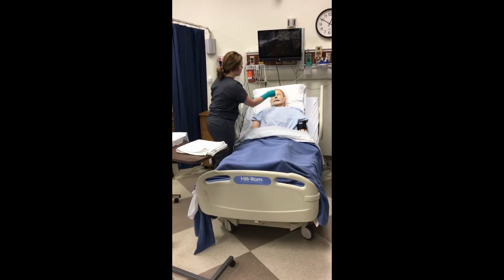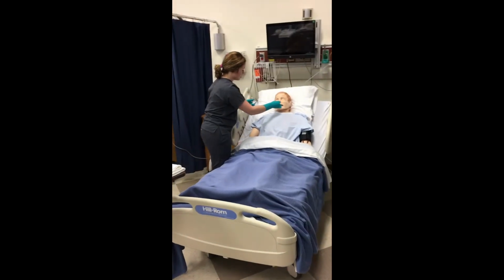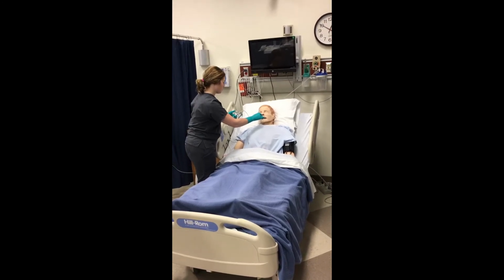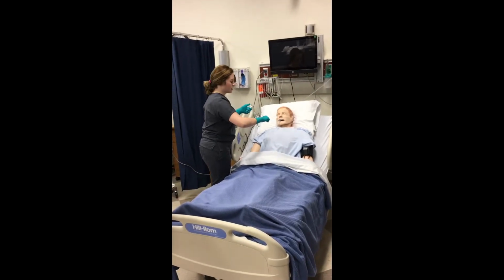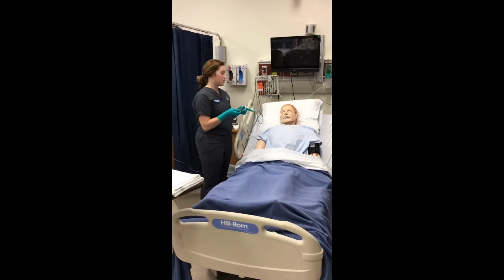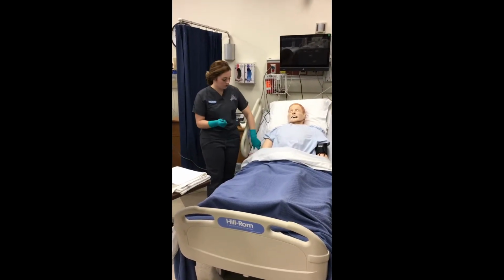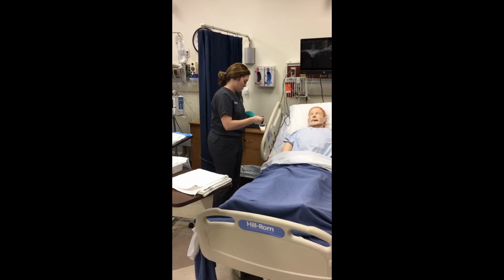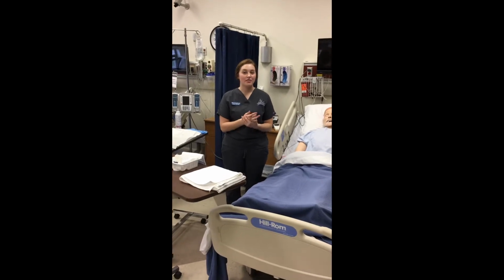As I am pulling the nasopharyngeal tubing out, I will be applying intermittent suctioning and twisting the tube. Okay, now that it's out, I'm going to assess and make sure the patient doesn't need any further suctioning. Possibly they may need it in the other side of their nostril. If they don't, you remove it, wrap it in your gloves, dispose, and you're going to document everything you've done.